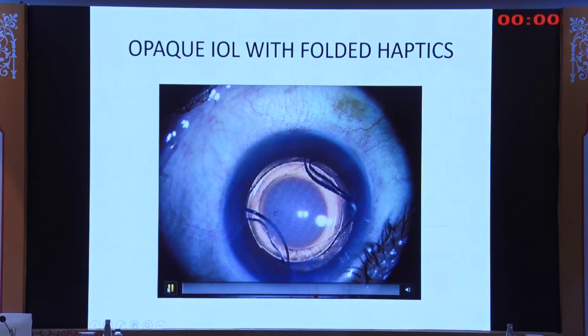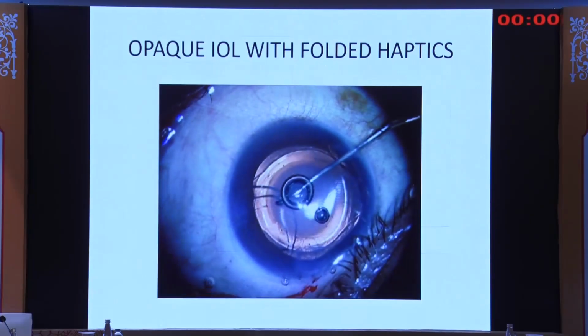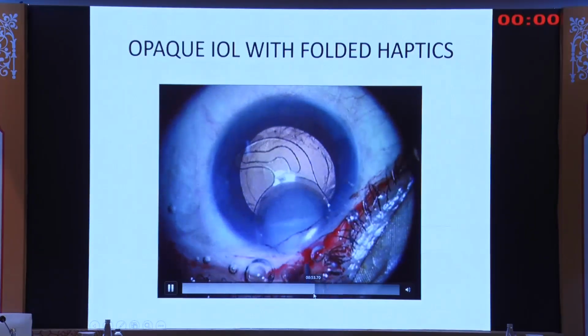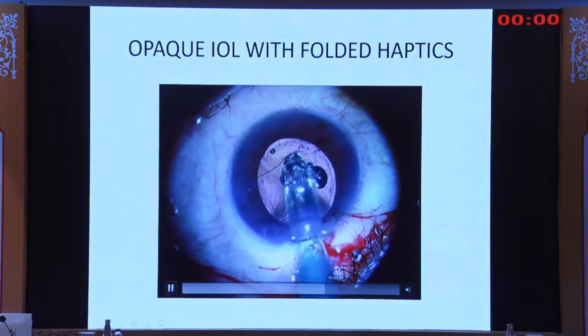So how to manage this? This is not easy because the folded haptic comes out of the bag very easily. Just bring it out, take it out from the opening, and place another lens in the bag only.